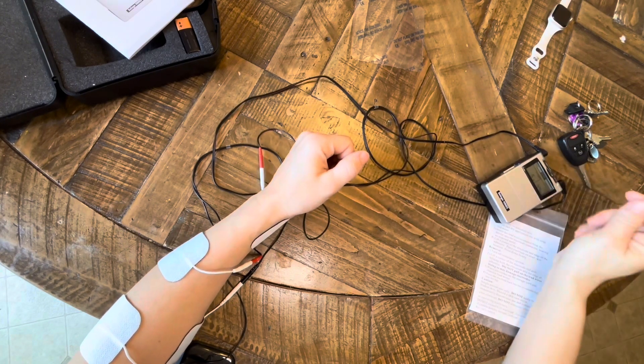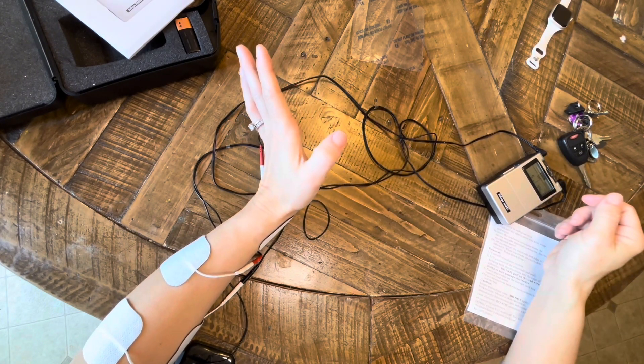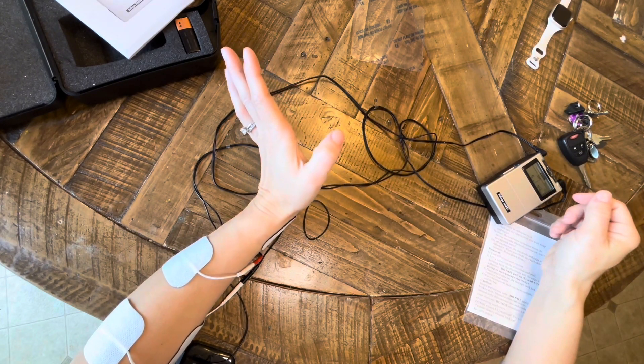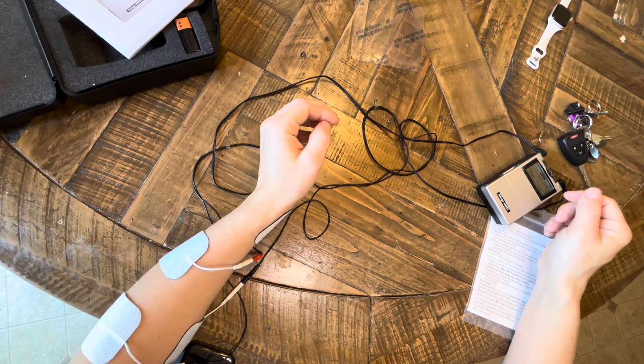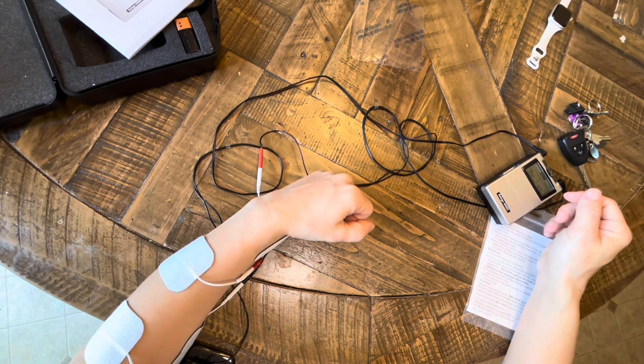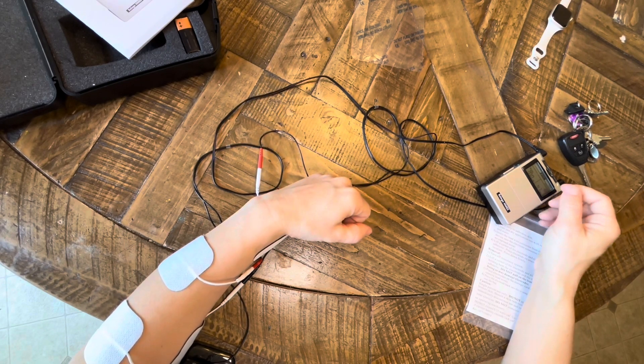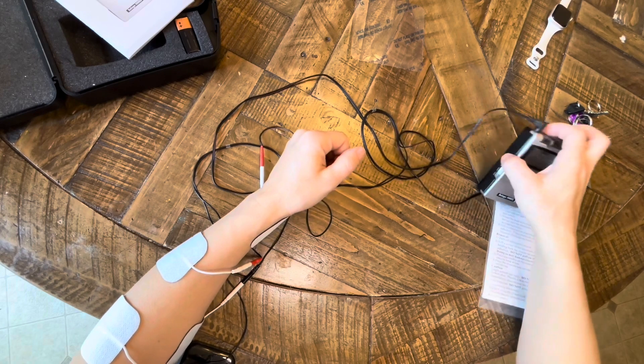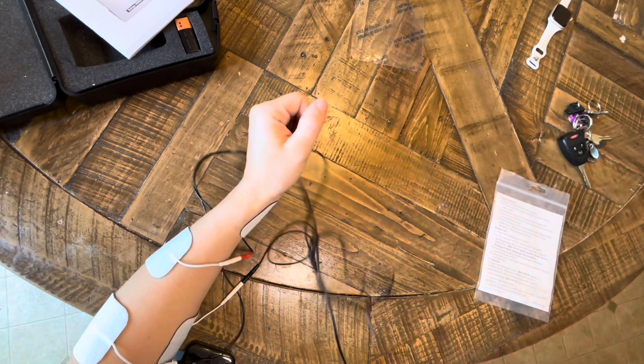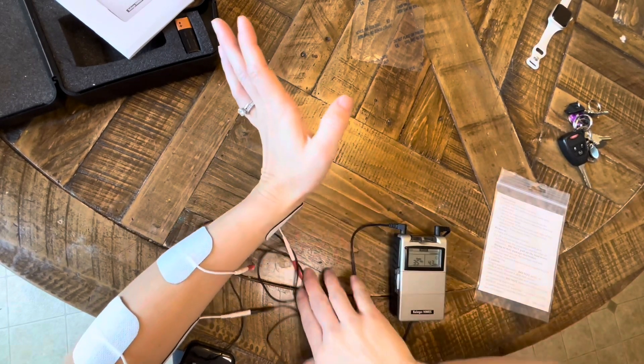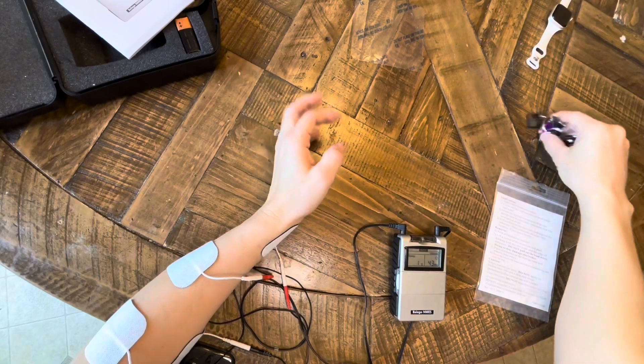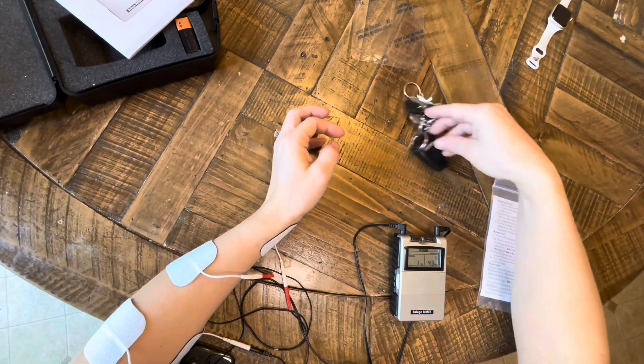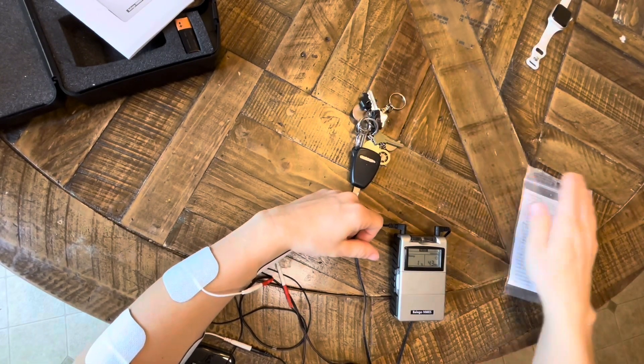Okay, so I set the amplitude that I want. I'm getting good finger extension, I'm getting good finger flexion. It's tolerable, it's not too painful. So now I'm going to do my grasp and release activity again.